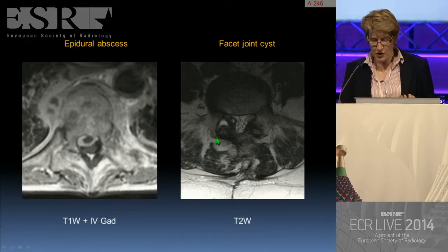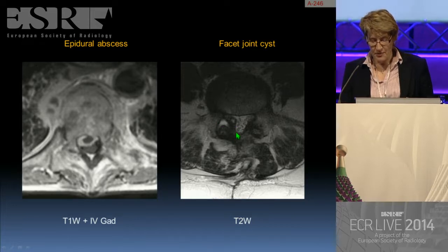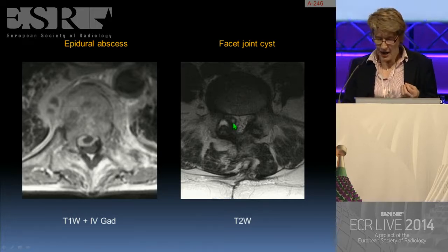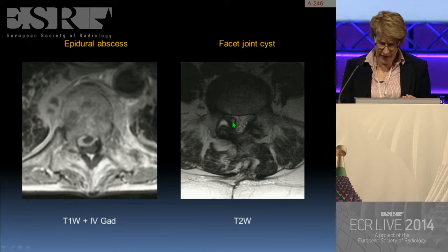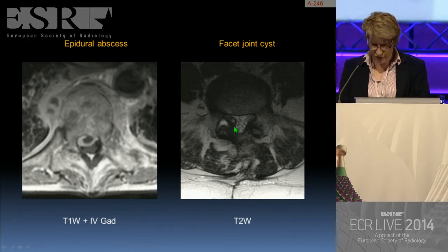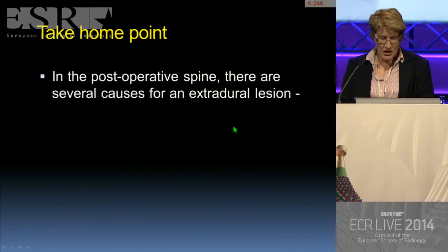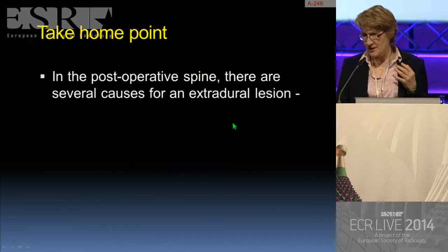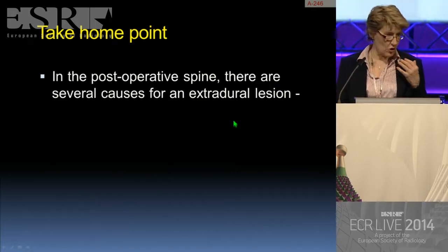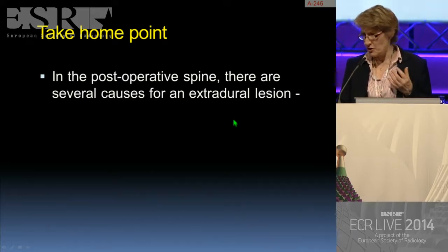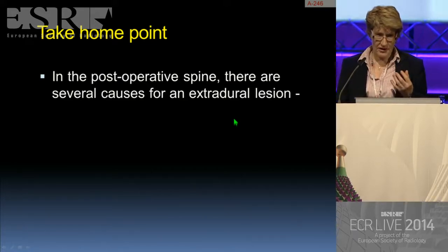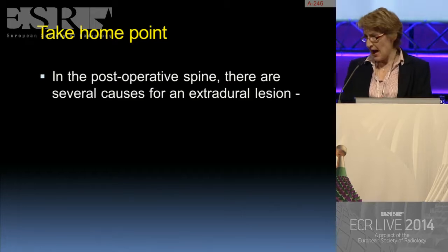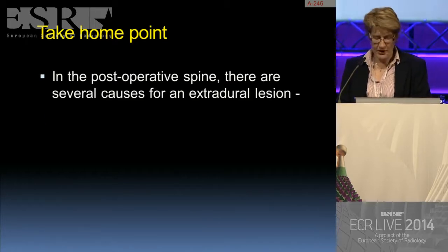The facet joint cyst: in this example we've clearly got facet joint hypertrophy, some hypertrophy of the ligamentum flavum, and on the T2-weighted sequence a small cystic focus projecting into the spinal canal, associated with often excruciating sciatica. In the post-operative spine there are several causes for an extradural lesion — not always post-operative epidural fibrosis, not always just a recurrent disc herniation. Consider those in conjunction with the clinical presentation.